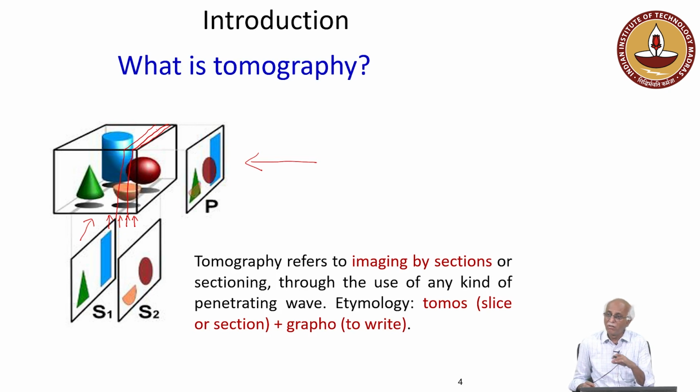These photon frequencies will not be ionizing. Of course, if I use a very high intensity beam, there is a possibility.